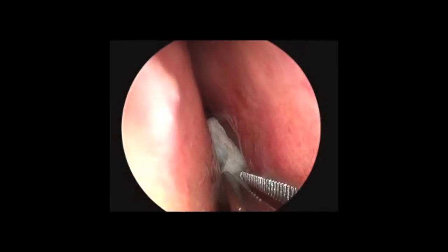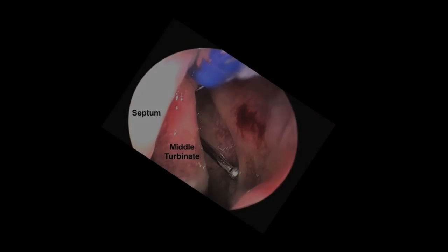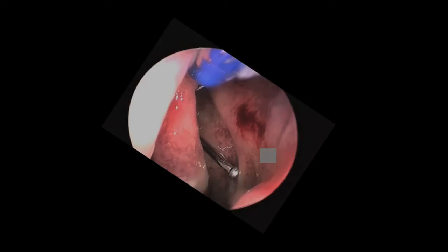To start the procedure, local anesthesia is applied with pieces of cotton, one of which I am removing here. This picture is on the left side. You can see the middle turbinate and the nasal septum. This is the uncinate process. The natural opening to the maxillary sinus is behind the uncinate process, where this gray block is shown.